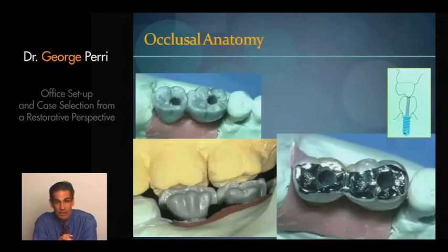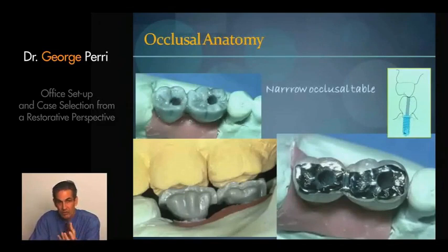Quite often, practically, the implant is placed more lingually than would be ideal, and then to achieve a full contour to that restoration, we end up with a significant labial cantilever. What we need to do is to perhaps limit or narrow the buccolingual dimensions of our restoration to the point that we keep the occlusal contact closer to the implant position.